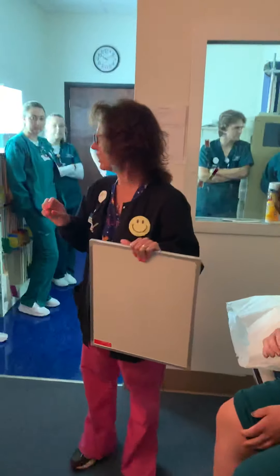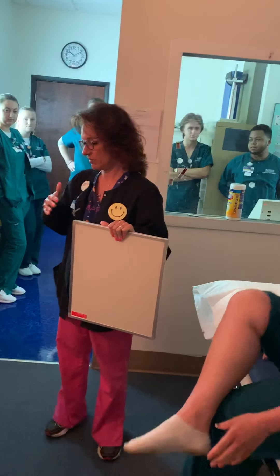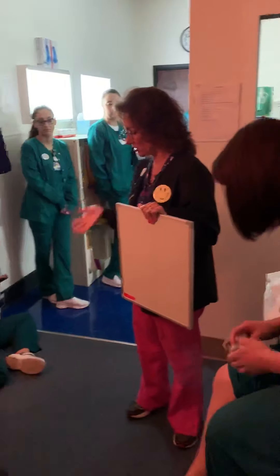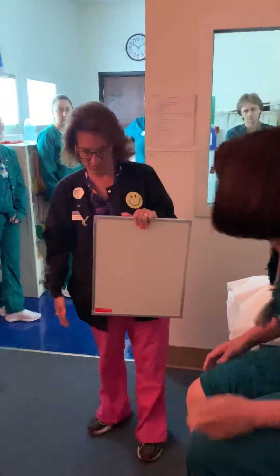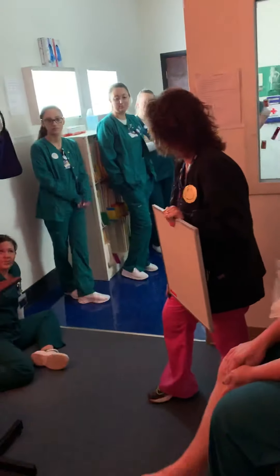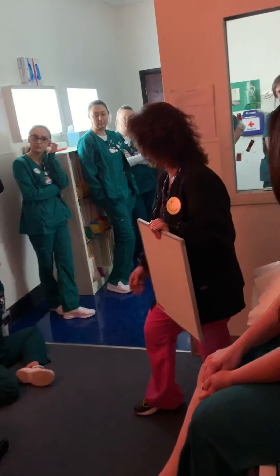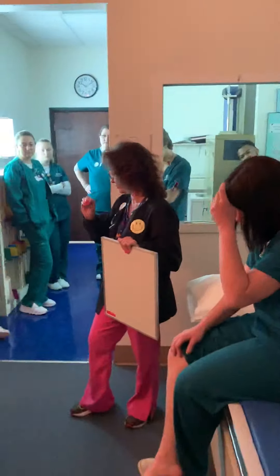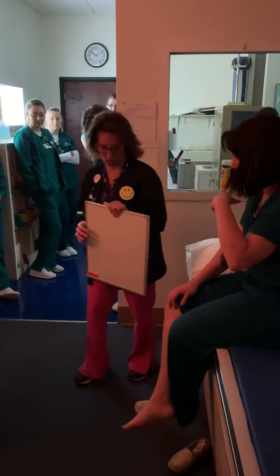When you do tib-fib, you have to have both joints free of anything — so ankle and knee. If they have socks and shoes, they have to come off. And if they have pants, especially with digital, you probably want them to change because denim will show. With digital, everything shows on the images, so you probably want just skin.